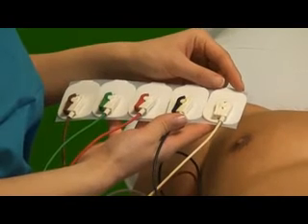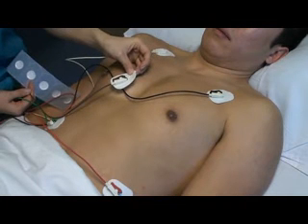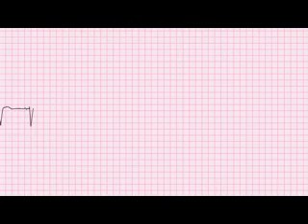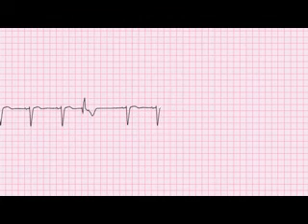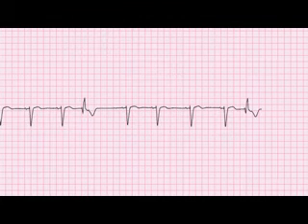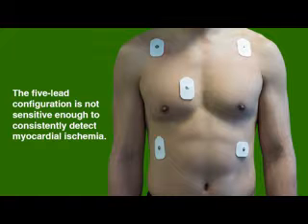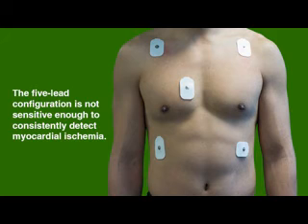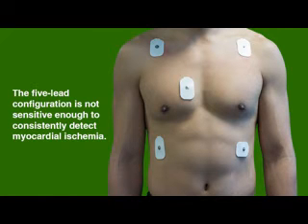The five-lead configuration includes electrodes placed on the four limbs and one precordial electrode, either V1 or V5. This configuration allows for the recording of a true V1 lead, which is necessary for the accurate diagnosis of arrhythmias associated with a wide QRS complex, such as bundle branch blocks or ventricular pacing. Unfortunately, because of the lack of multiple precordial leads, the five-lead configuration is not sensitive enough to consistently detect myocardial ischemia.